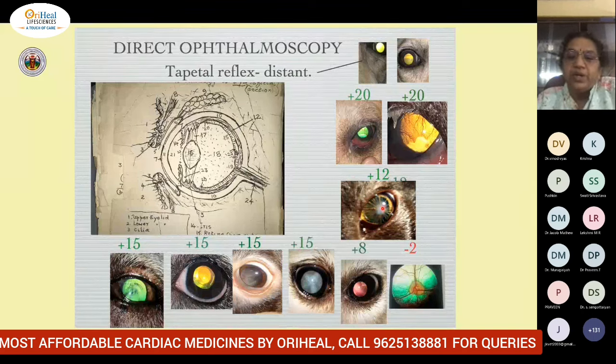And now coming to the anterior chamber, further down, you can work on the plus 15. Okay, you have four plus 15s. But what structures are you going to see here? In the same thing, because you are seeing a pathology, that's why I'm telling you. In plus 15, you are able to see the lens. Plus 12 also gives you a little about the anterior chamber and the lens.